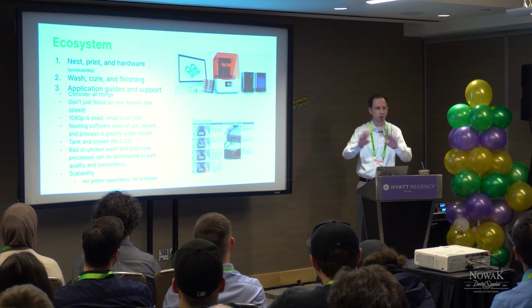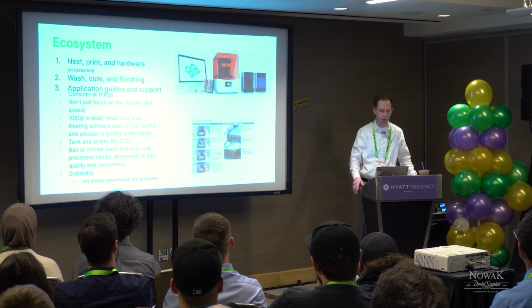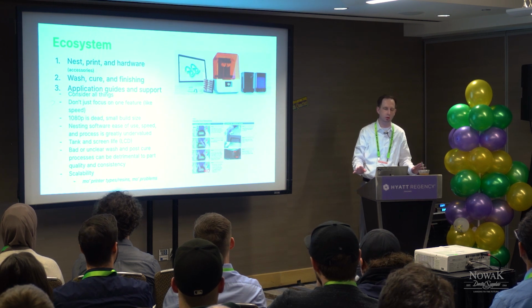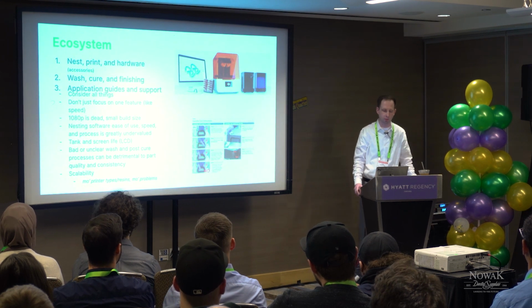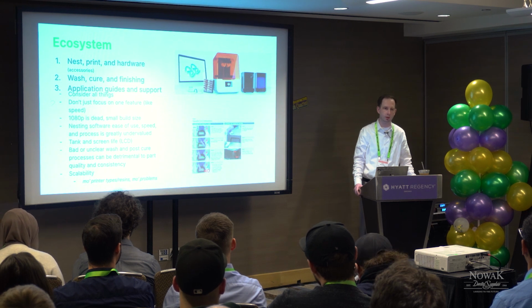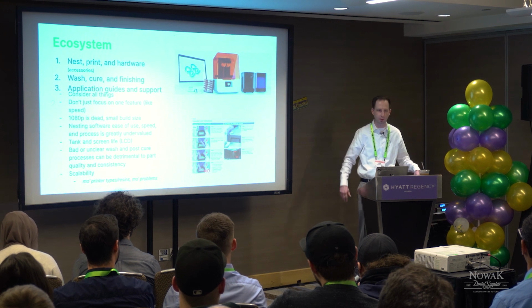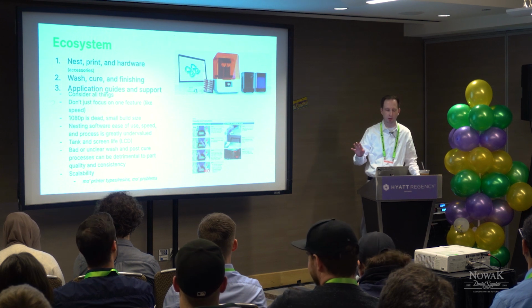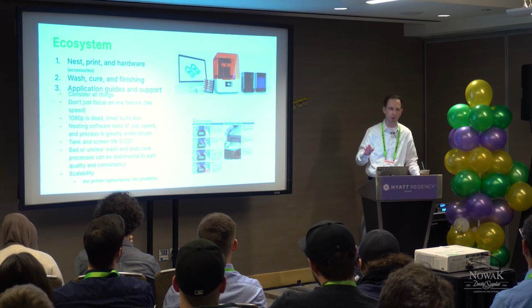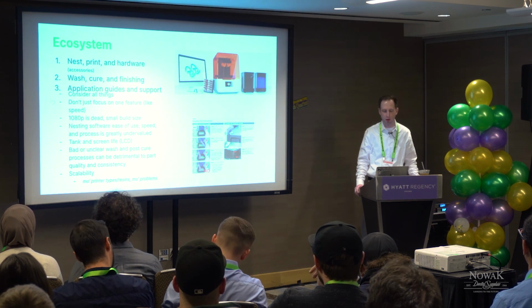1080p is dead. Nobody buy a 1080p printer today, please. 2K or up only. Build plate size makes a huge difference. It makes everything easier. These tiny build plates, unless you want to run a whole farm of them, which I ran a 20 printer farm, it's not fun. Get home, my kids can't even touch me because I've got isopropyl and photopolymers all over me. Skip 1080p. We're finally to the point where there are great viable printers with good build plate size. So that's the technology of yesteryear.